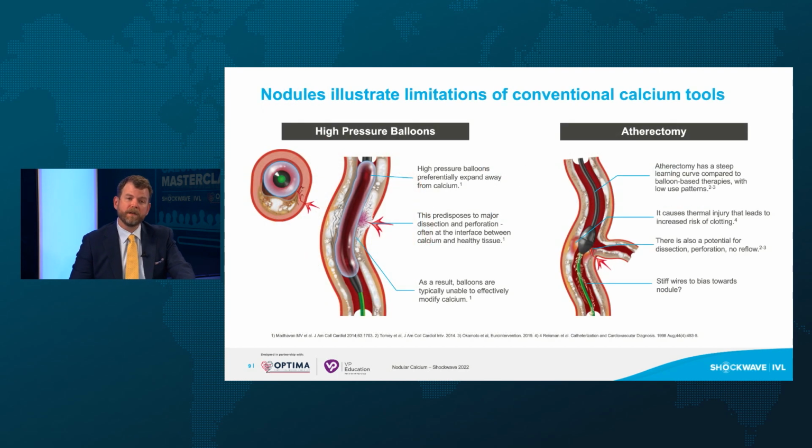Our traditional methods of treating calcium are going to be very similar for our calcific lesions and our nodules. Unfortunately, specialty balloons, whether they be NC, cutting, et cetera, again, they're meant to expand away from the problem at hand. They're going to go to the area of least resistance, really not treating the issue at hand, which is the nodular heavily calcified segment.